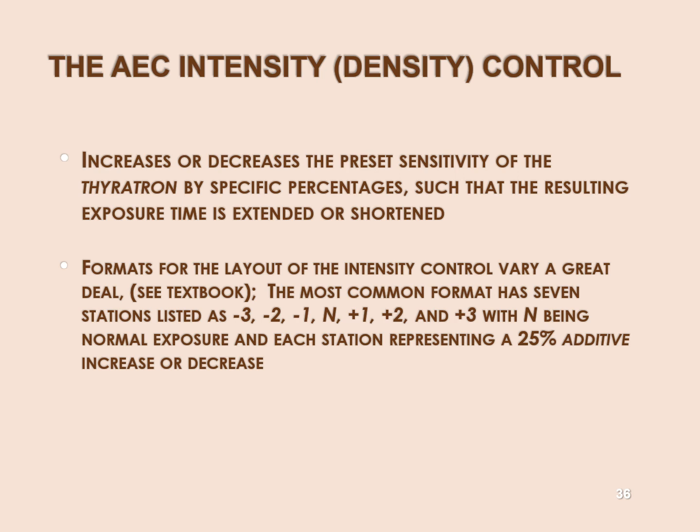The heck am I supposed to do with this? I know, I'll divide all the intensities by 3, and then I'll send them off to the processing software. That's basically what automatic rescaling does. It's taking your overexposed technique and scaling it back to a range of values that the computer is expecting for the next batch in the software.